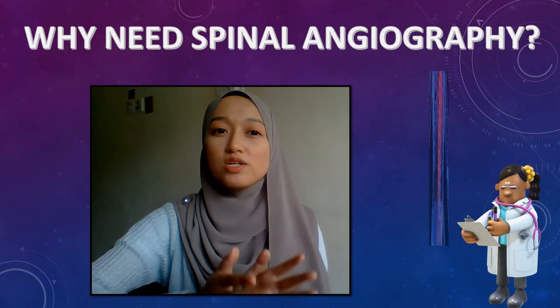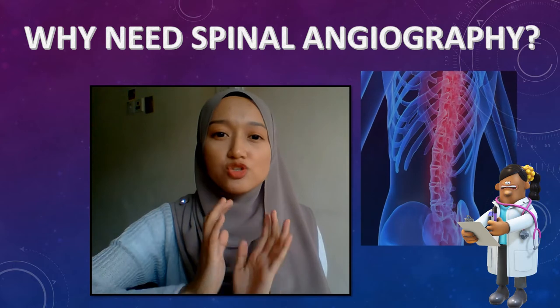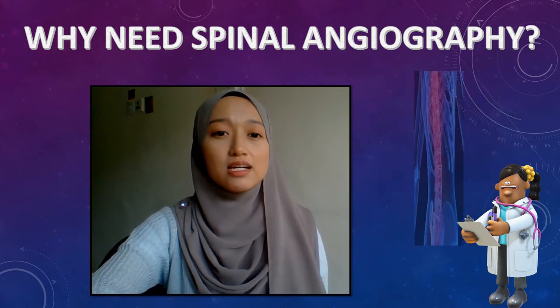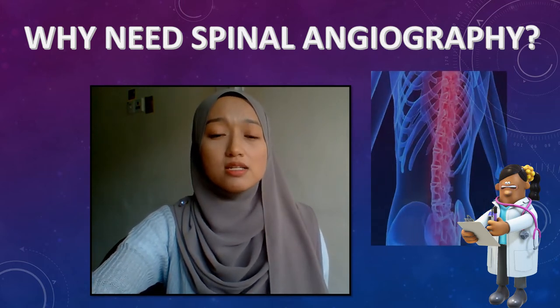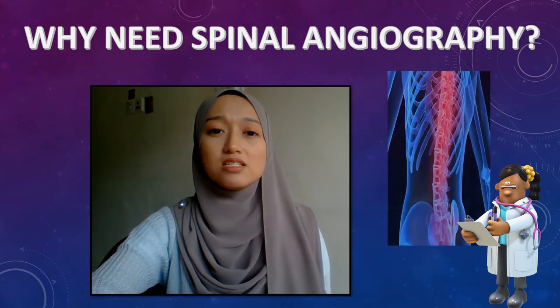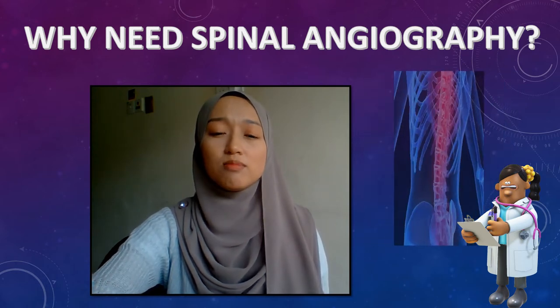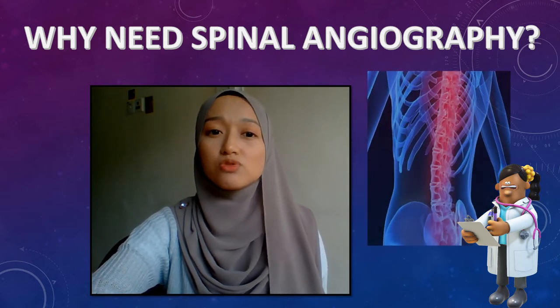Do you know why your doctor recommended spinal angiography? Your doctor may order a spinal angiogram to learn more about your spinal tumor. In cases of spinal cancer, angiography is often used to help your surgeon understand if your spinal tumor is surrounded by a lot of vascular structure such as veins, arteries, and blood vessels. Knowing the extent of these vascular elements around your spinal tumor will help your surgeon prevent any complications during surgery, namely significant blood loss.